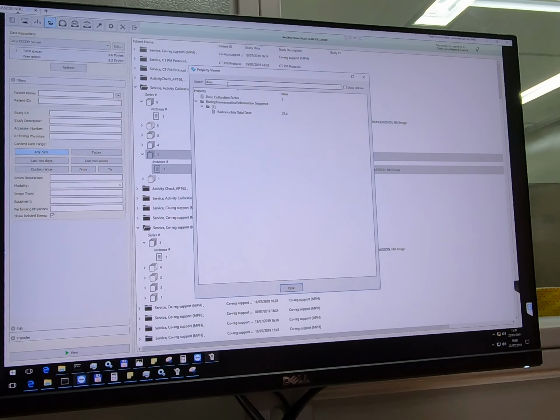Once, yeah, there is a manage. Oh, yeah. It's not like the PET, because in case of the PET, you can record that radionuclide window just before the reconstruction. So after the acquisition, it's still modified. But it's not true for the SPECT. So you have to fill it in before the acquisition starts.